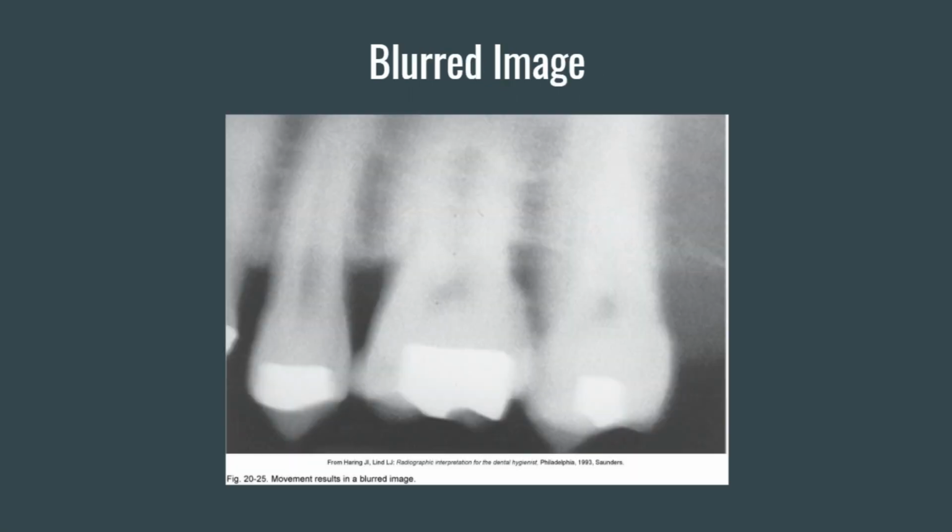This is a blurred image. This is from the result of movement. So either the patient moved as the photo was snapped, as the film was exposed, or possibly the PID moved.